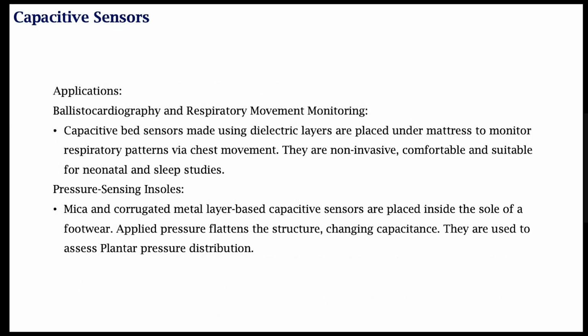Okay. Polysomnography, sleep studies, and breathing studies. In many cases, spirometry is a method that we use to study breathing, is it not? In many cases, there is a nearly 100% correlation between spirometry and the study of breathing using non-contact methods with capacitive sensors.